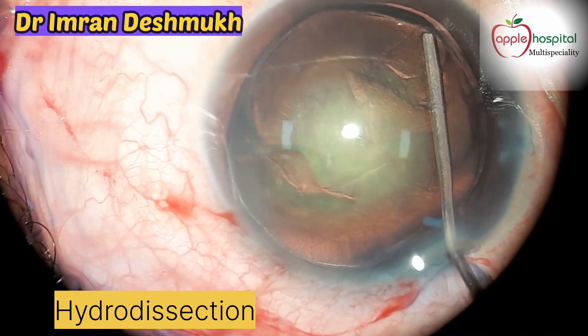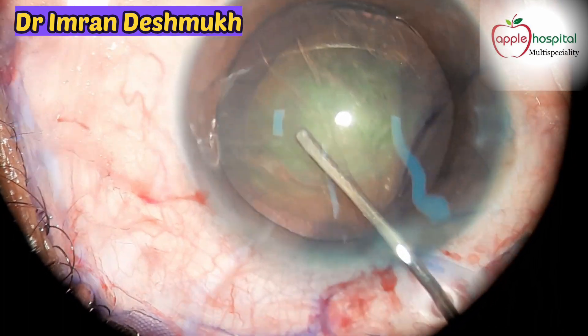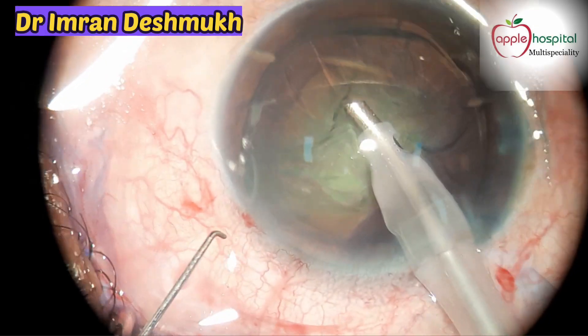A small gush of fluid is used — see, you can see the wave. The wave gets trapped at the center of the nucleus, so the excess fluid comes out. Now the nucleus is a bit free.